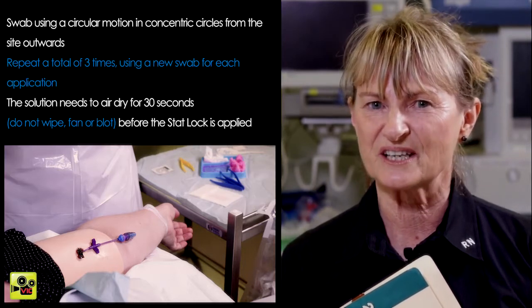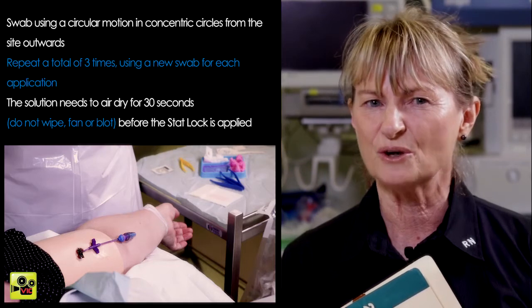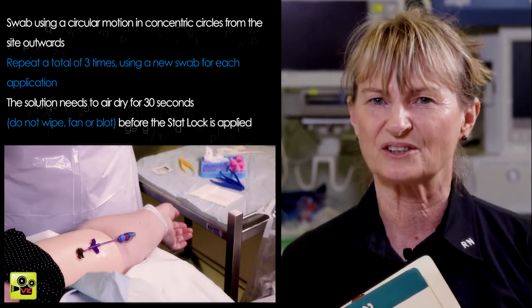The solution needs to air dry for 30 seconds. Do not wipe, fan or blot before the StatLock is applied.